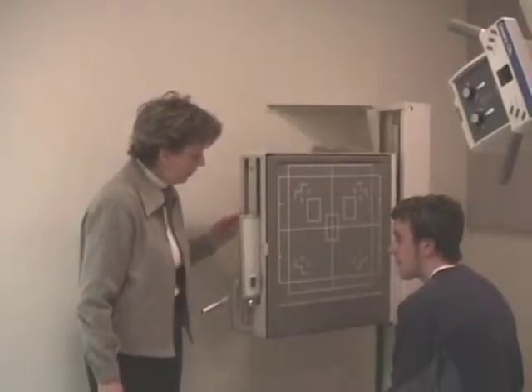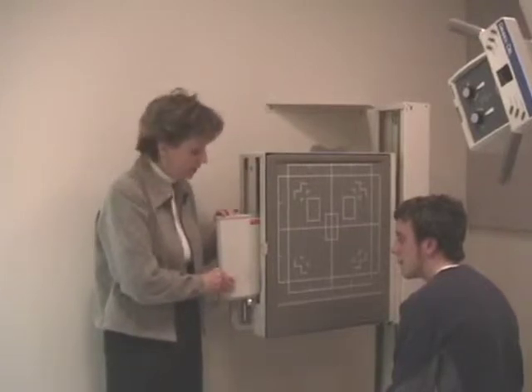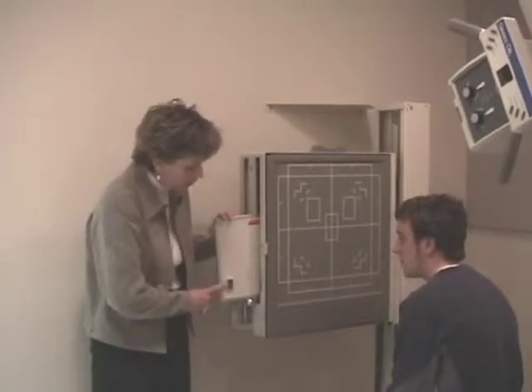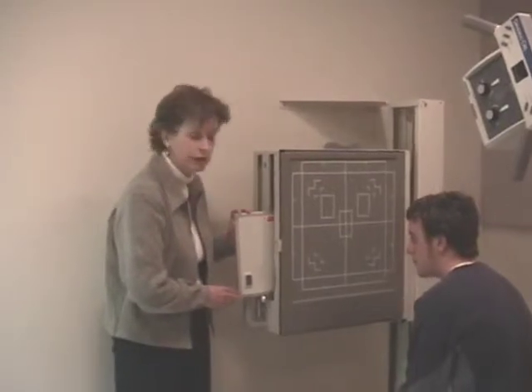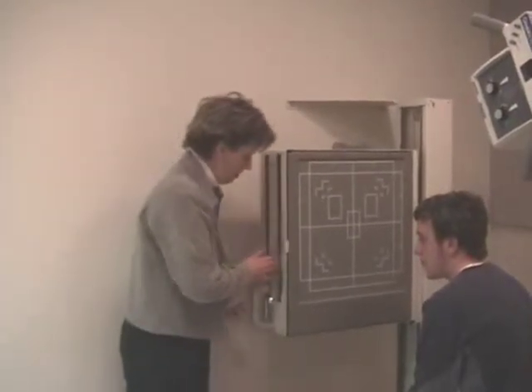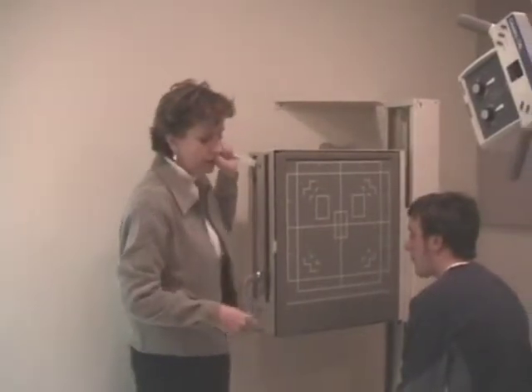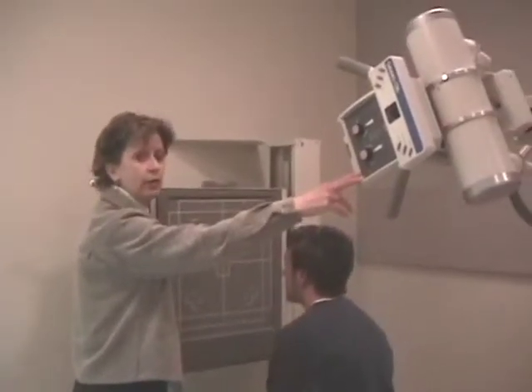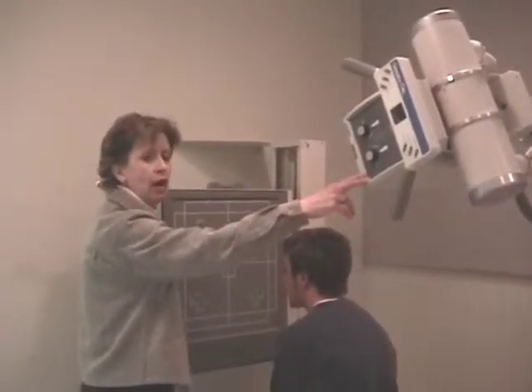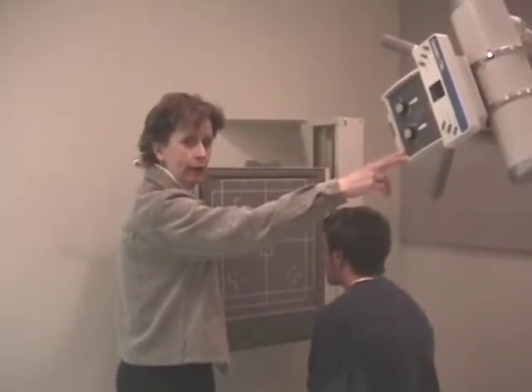We're set up at the vertical board. I have an 8x10 in the wall bucky with the ID to the top. I've moved the left marker in a ways because we're going to have about 7x7 collimation. My patient is shielded, and I have my tube set up for the PA axial, also known as a Caldwell. It has a 15-degree caudal tube angle on it.